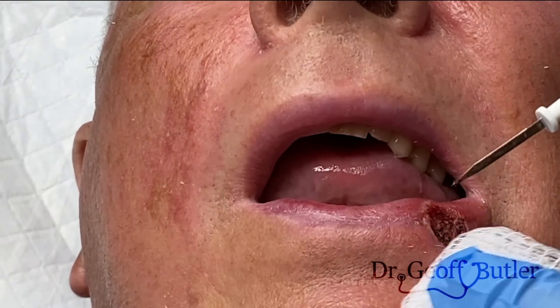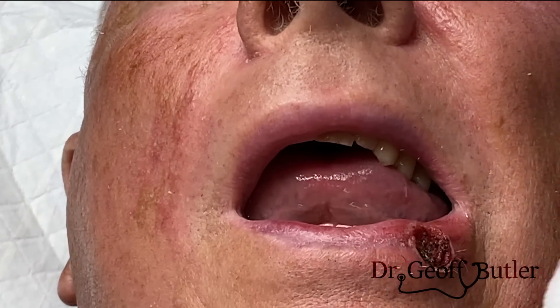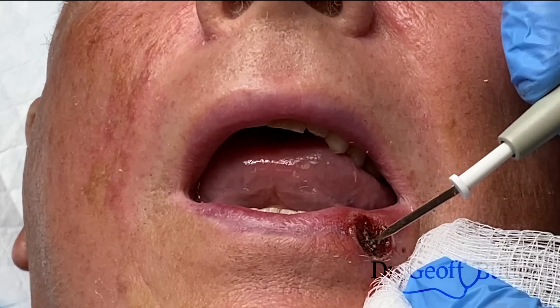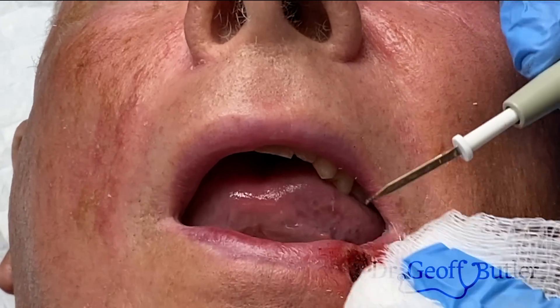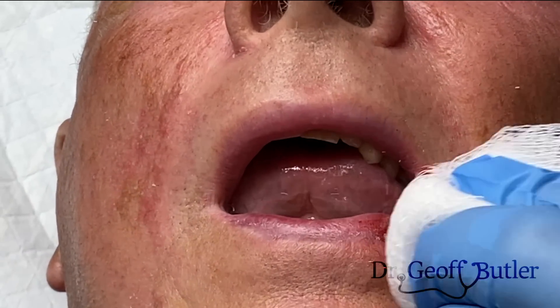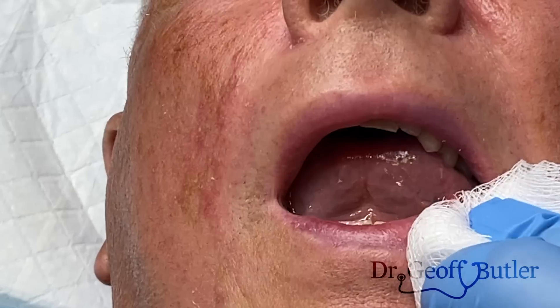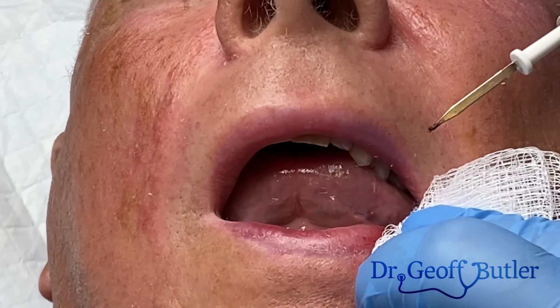You can tell it's starting to settle back down — it's starting to cauterize more like normal tissue behind it. All I want to achieve here is a basic coating so it's not bleeding too much.